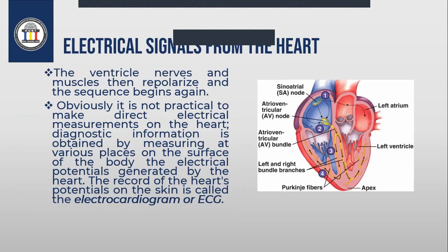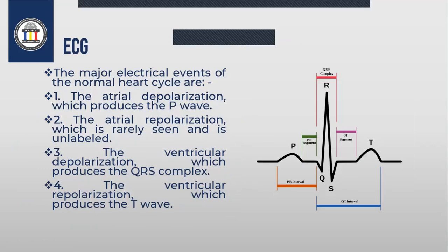Okay, so this is how it works. The record of the signal coming from the heart we name the electrocardiogram, or ECG. The normal shape of the electrocardiogram starts with the P wave, which is the depolarization of the atria. The QRS is the action potential happening in the ventricles, while the T wave is the repolarization of the ventricles as well.